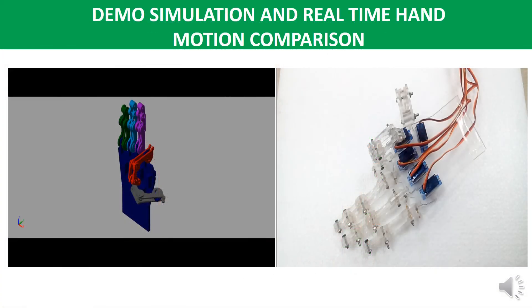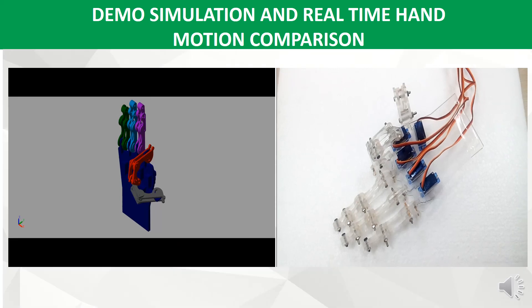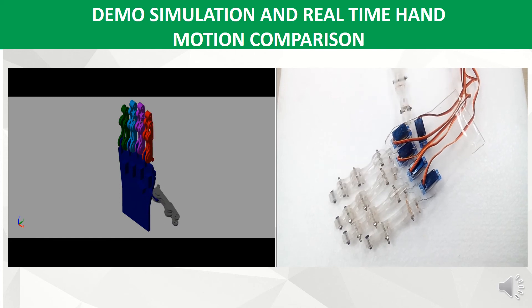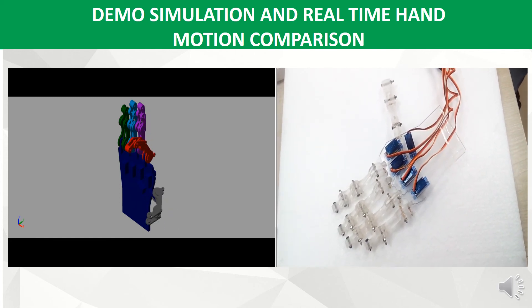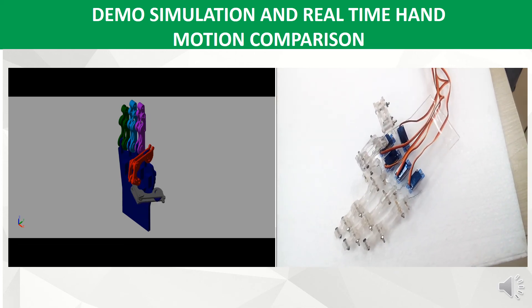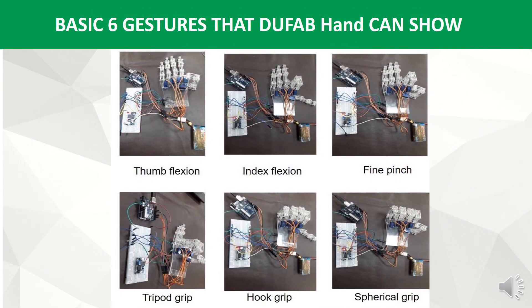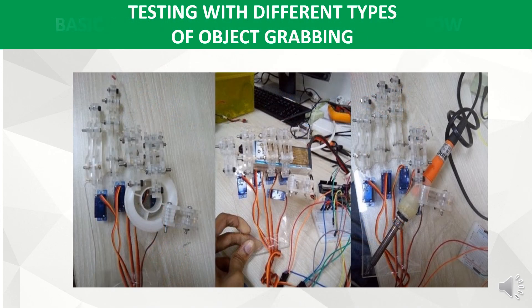Now I will show a demo simulation of gesture classification performed in MATLAB using the classified signal as input. You can see the real-time movement performed simultaneously; the performance in both cases is quite close. For time constraints we have shown one movement, but you can contact us for other movement videos. Basic gestures of our hand are shown, and we also tried to use this hand for grabbing different objects.